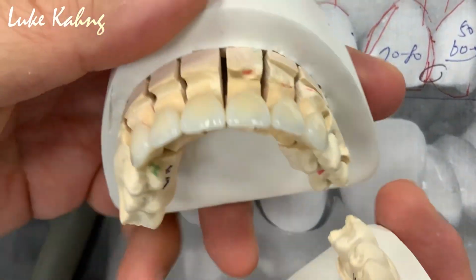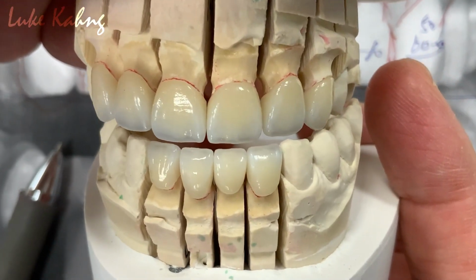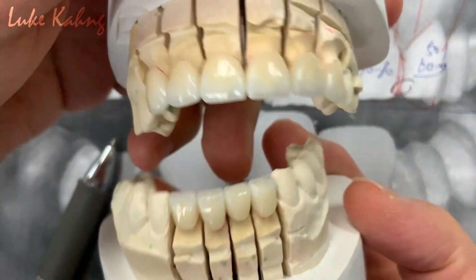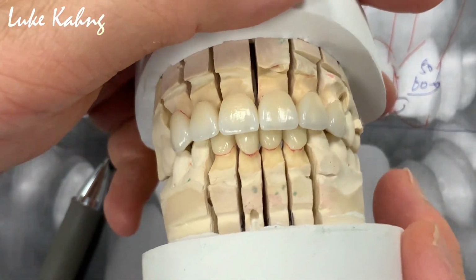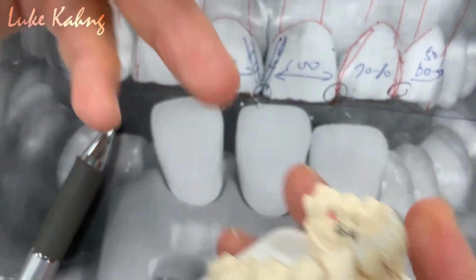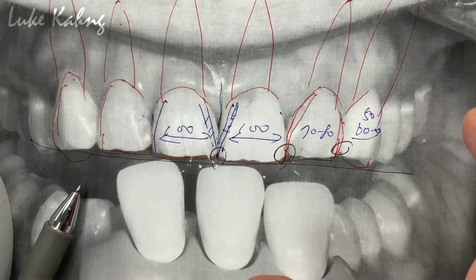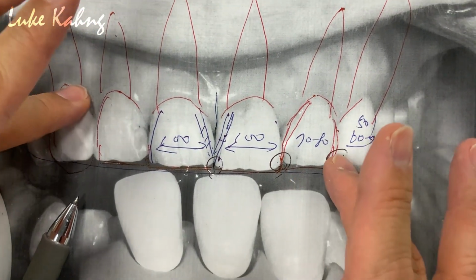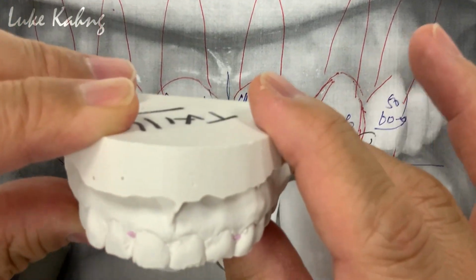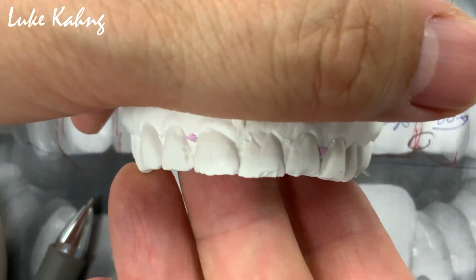And whenever we mount the cases, the orthocentric, that is the best bet for that. From the before, we make the treatment plan wax up, and then I have to make the putty, and then we send it to the doctors. So this is the before, right?